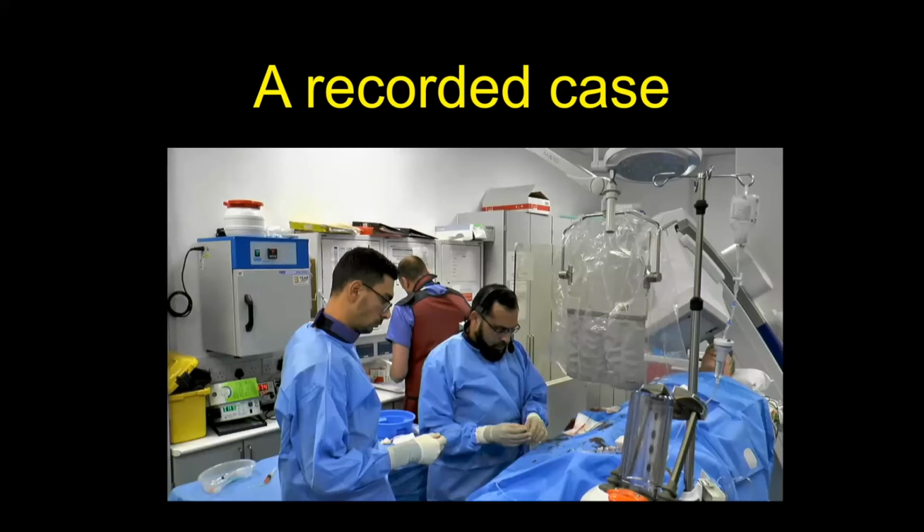But if somebody has moderate atheroma, which you will probably see in those who are elderly and on treatment, unlike this guy whose rest of the vessel was very normal looking, which is why I treated him medically, then where there is moderate plaque burden and plaque rupture, you might want to stent it. I don't think there is anything against it. I think we need more evidence for that.